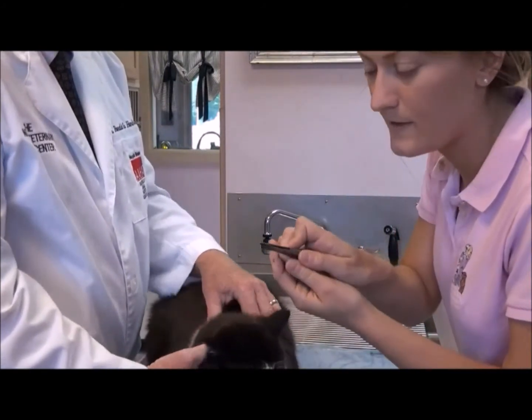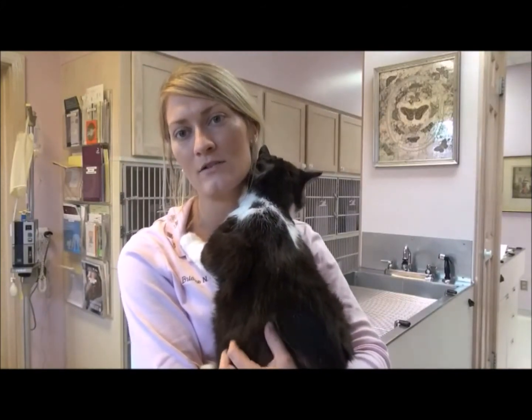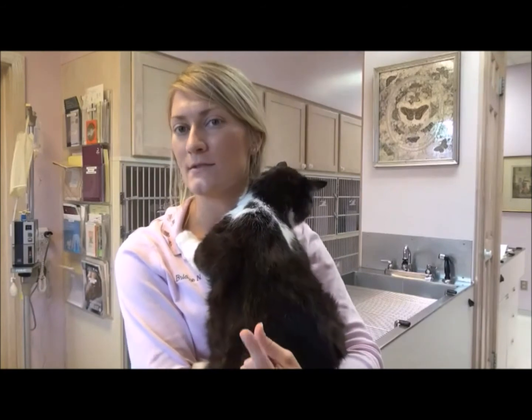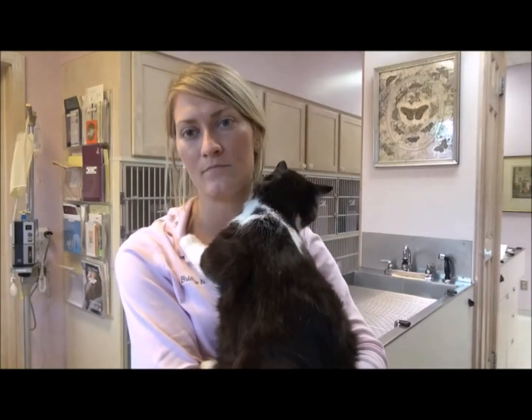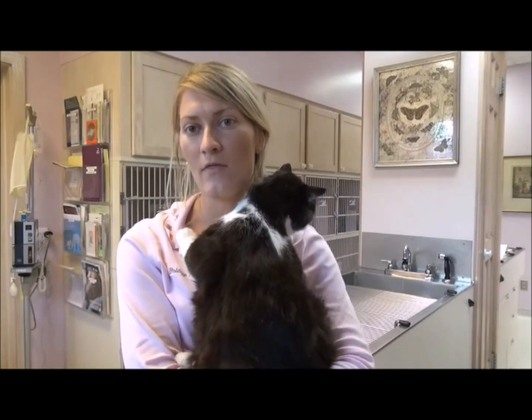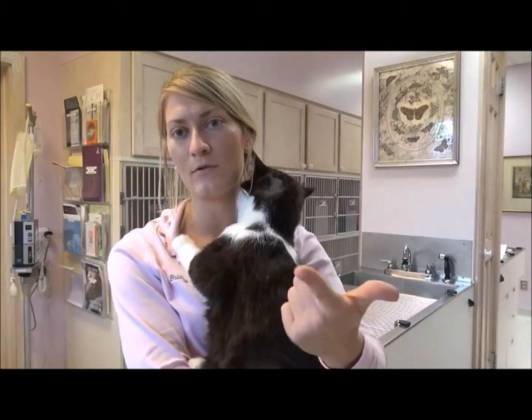Okay, easy as that. I could tell the staple was ready to come out of our patient following the punch biopsy because there's no redness, no swelling, no drainage, and there's no gap between the closure area. And those are really 4 key things that you want to look for that tell you a suture or staple is ready to come out.